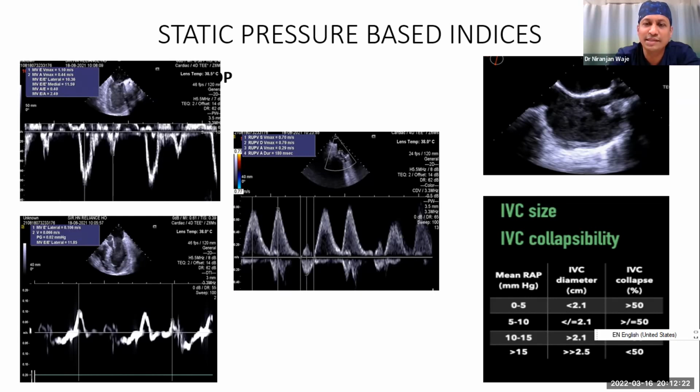However, they don't focus on the number. So if you have a PPV or SVV number of 8, 7, 6, you know not to give fluids, but they don't indicate accurately whether the fluid content is excessive and you need to administer diuretics. However, echo can help us in this condition.